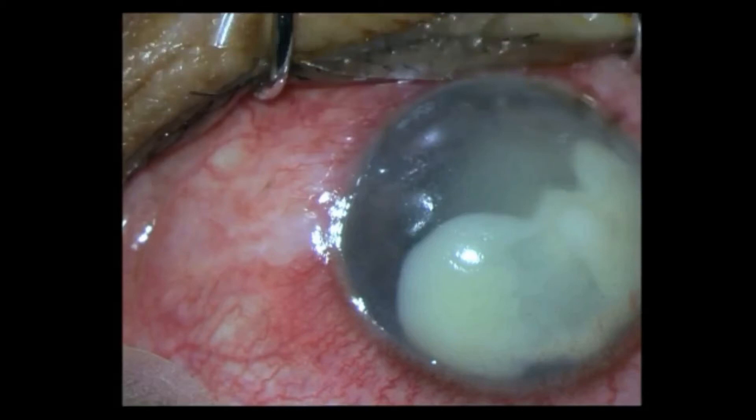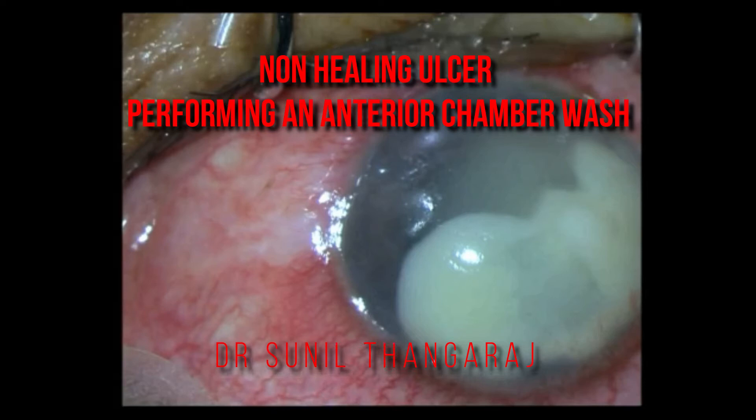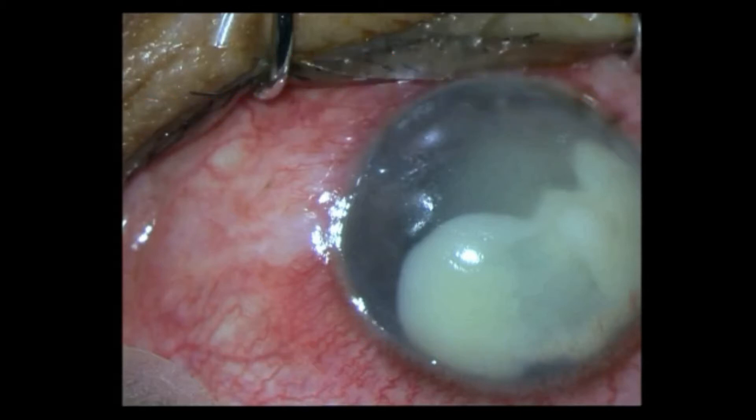This is a young agricultural worker with a corneal ulcer which is pretty ill-defined due to the thick organized hypopyon that you can see, and all exudates within the anterior chamber — a lot of coagulum. Other details of the anterior segment cannot be made out. He was treated; it was a fungal ulcer. He was treated with anti-fungals and anti-glaucoma drugs, however the picture essentially remained the same after more than one and a half months of treatment.